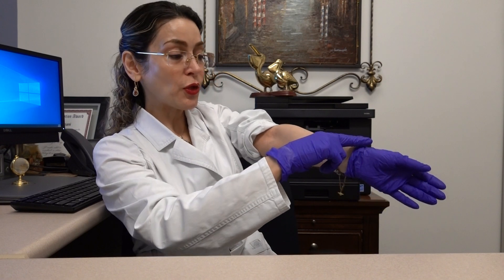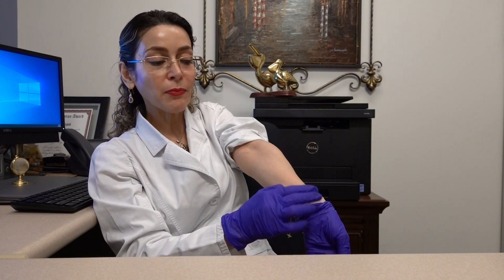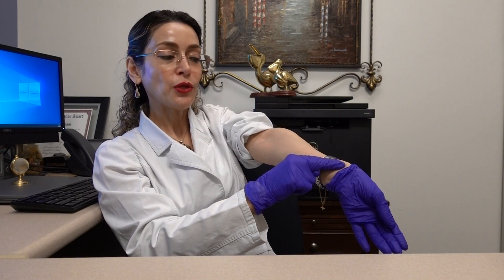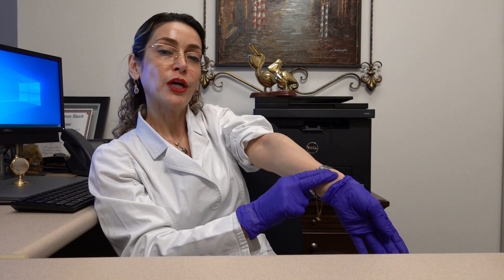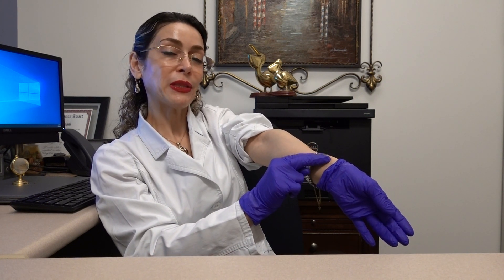The most common place to take the pulse of an individual would be the radial pulse. I go above the wrist — the radius is the bone that sits laterally exactly above the wrist, but medial to the bony projections. I press using my index and middle finger. Do not use your thumb, because it mixes your pulse with the pulse of that individual. So I'm detecting my own radial pulse — that's the most common place.